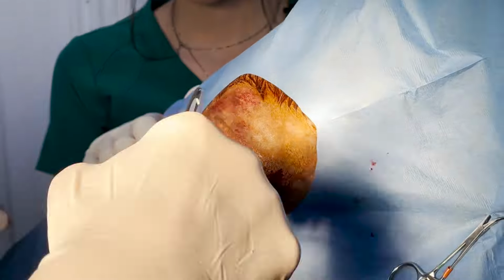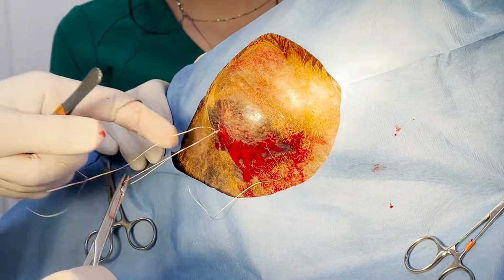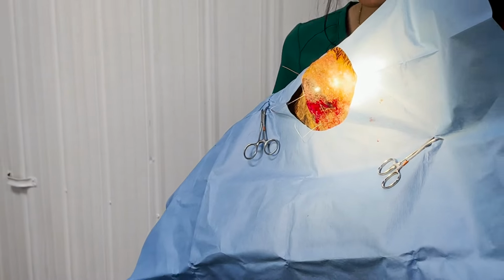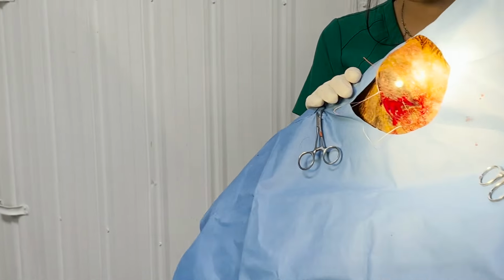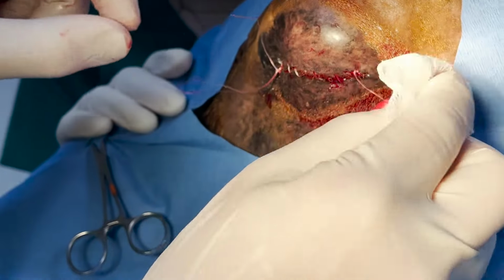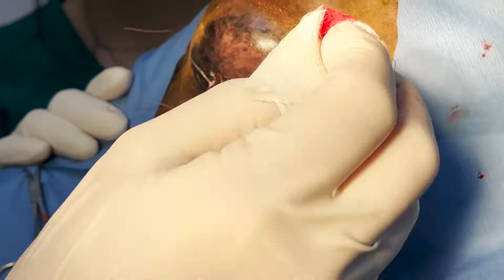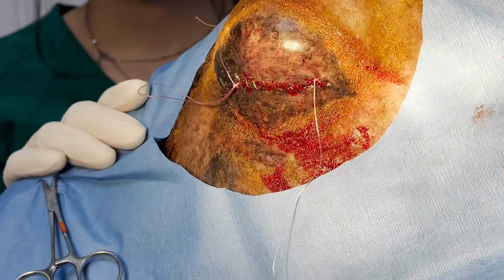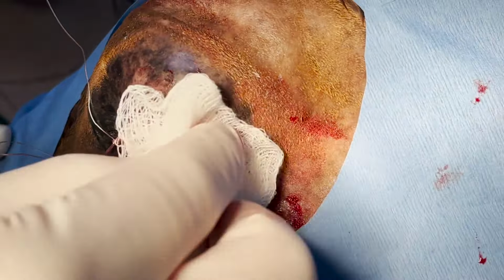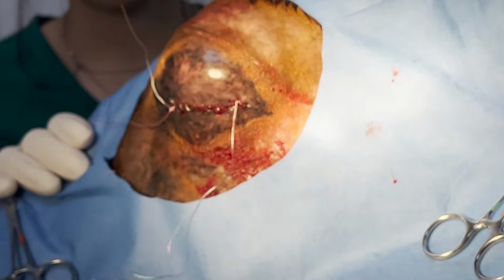And with the chronic inflammation, part of inflammation is increased circulation. So these do tend to bleed quite a bit more than anything else. And just in general, there's a lot of circulation to this area. So we will warn you, there will be quite a bit of blood in this video. But I can assure you she will not feel a thing. And she will feel better with that painful eye out of there.